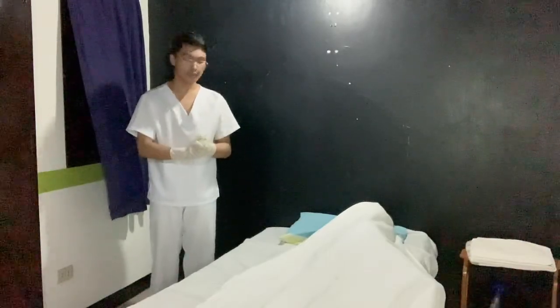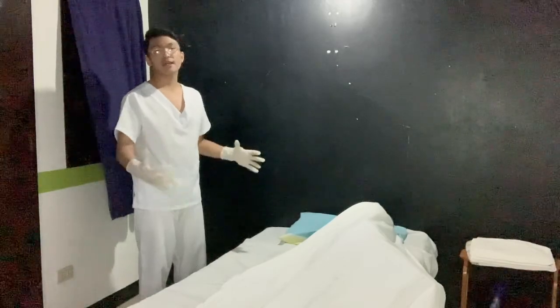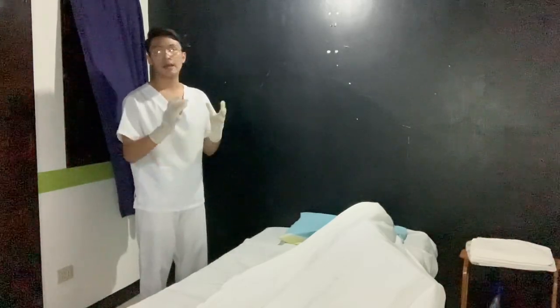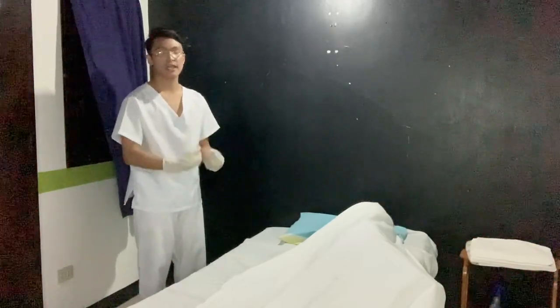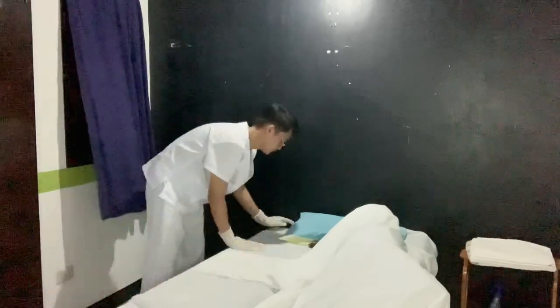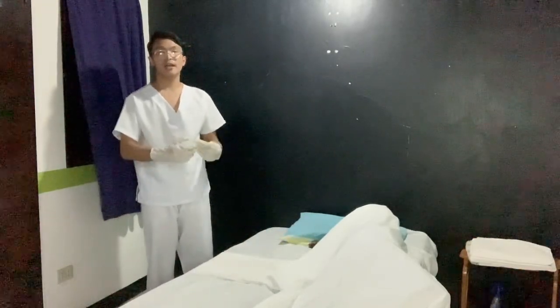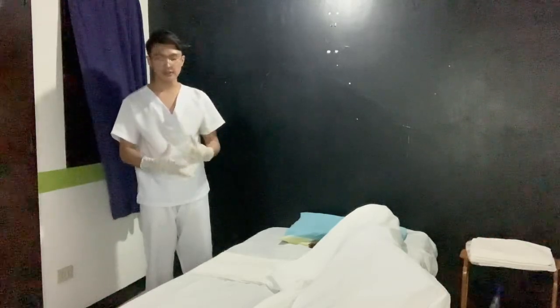Now I'm done pulling over the bottom linens and tucking it using the miter corner. I'm now going to pull over the draw sheet and tuck it under the mattress. Now I'm done pulling over the draw sheet and tucking it under the mattress.